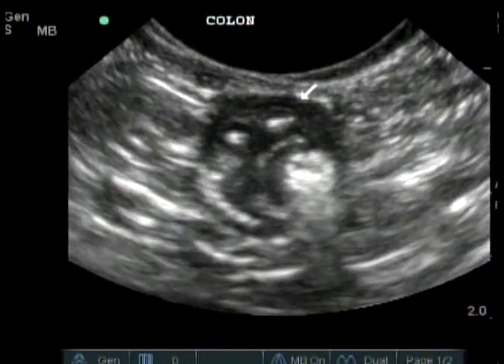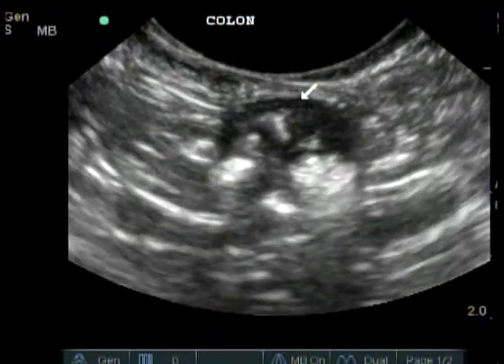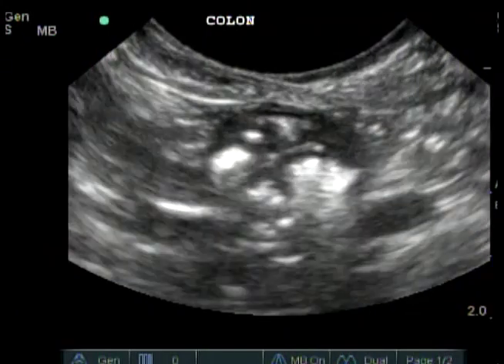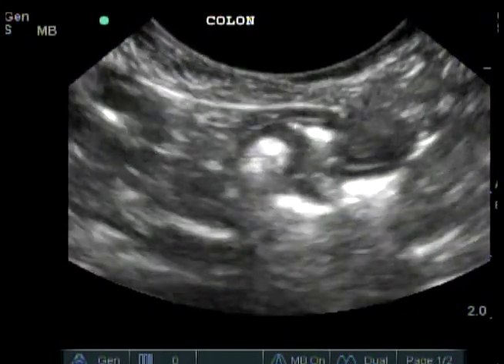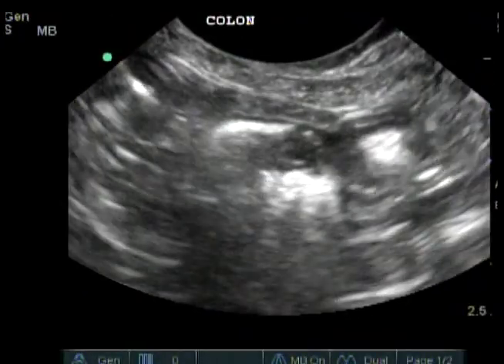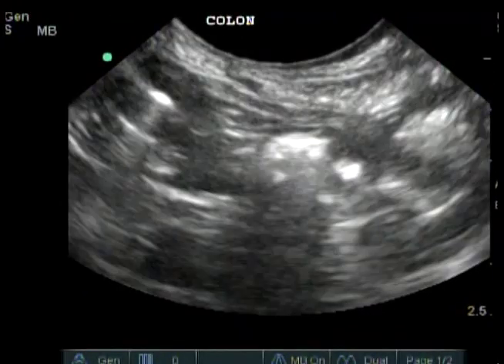The normal colon is usually easy to recognize because of its typical hyper-reflective proximal surface and distal acoustic shadow when fecal material is present. The wall of the colon has the same 5 layers as any other intestine, but all of the wall layers are relatively and equally thin.